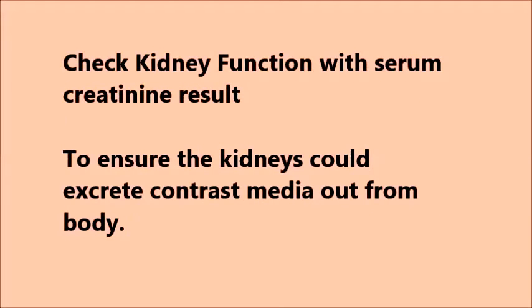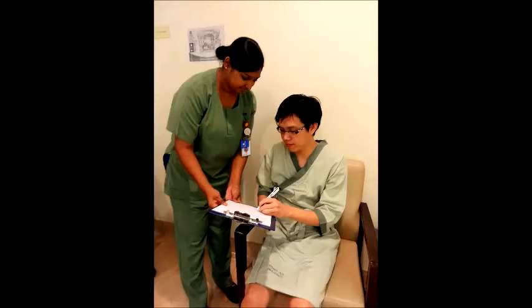We also need to check your kidney function level with the serum creatinine result in the blood test. It's to ensure your kidneys are functioning well to excrete the contrast media out of the body. You will be asked to sign a consent form after you have understood the risk and the flow of the procedure and to acknowledge you are willing to proceed.